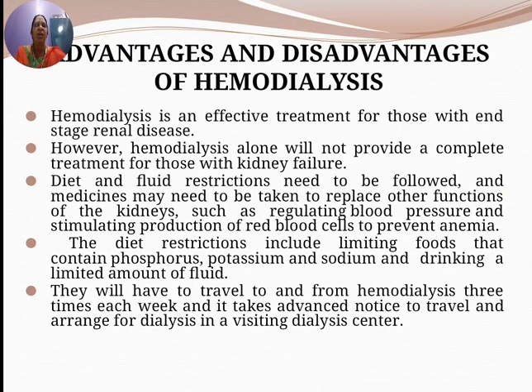Then the advantages and disadvantages of hemodialysis. Hemodialysis is an effective treatment for those with end stage renal disease. However, hemodialysis alone will not provide a complete treatment for those with kidney failure.